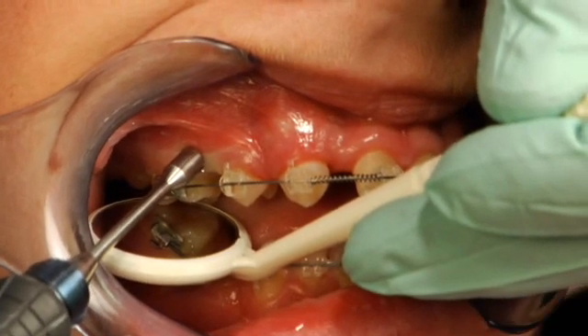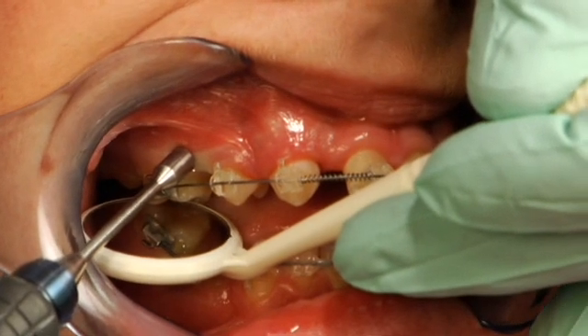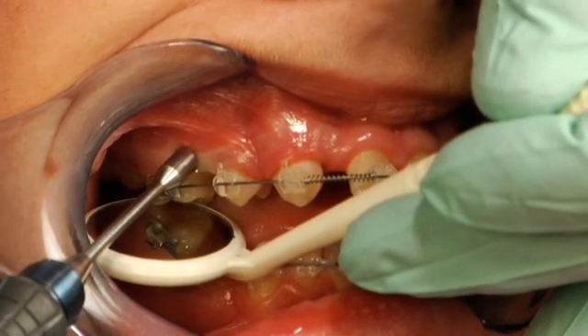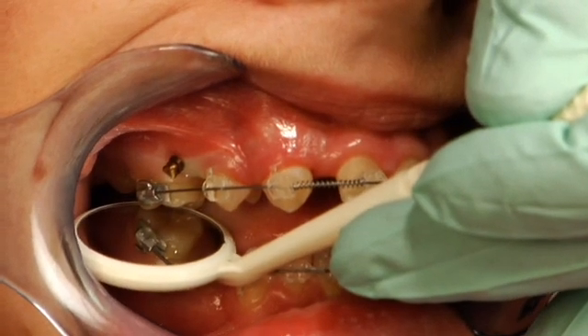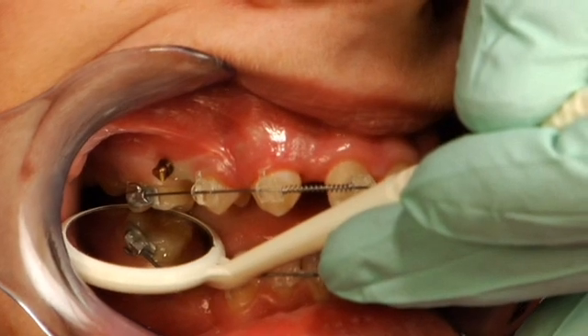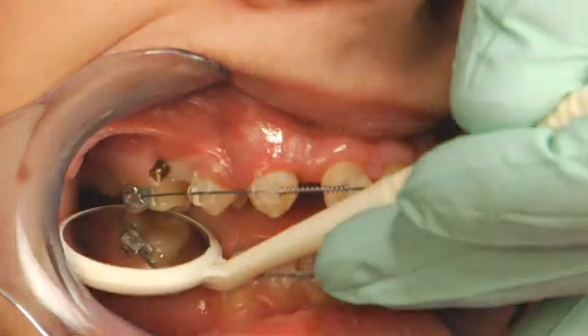If you notice, the head of the driver is now flush with the tissue, and that's typically where we know that the screw head is probably driven to the right depth. Then we're going to remove that and evaluate the emergence profile — determining whether the screw is positioned in enough, if it's sticking out, and if it's the right angle.